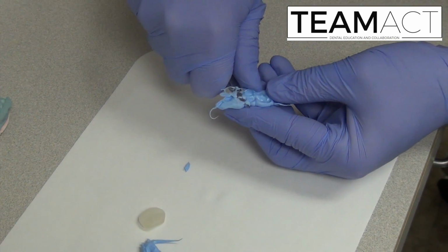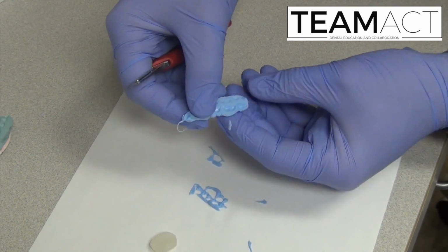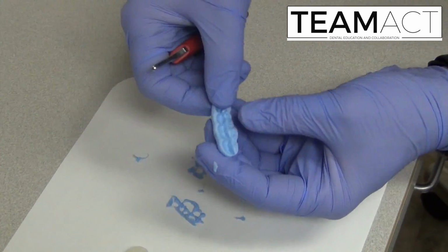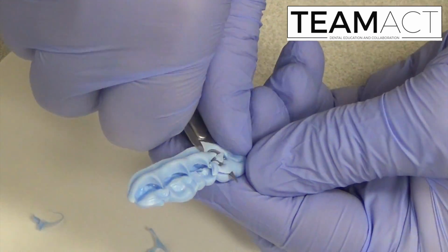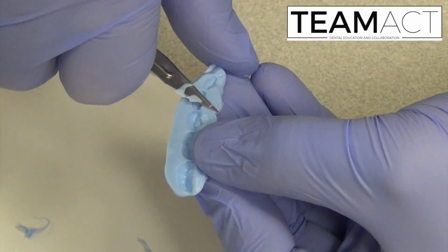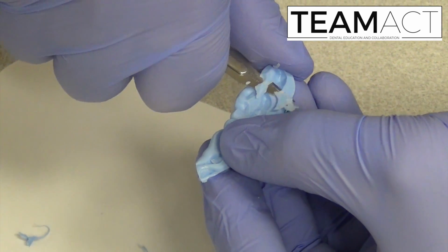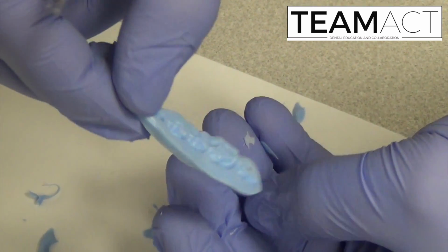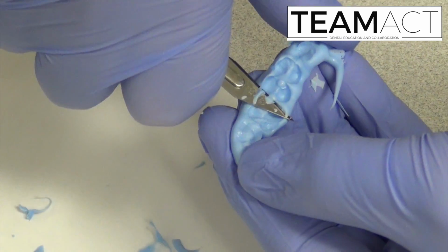To properly trim the CR record, I'm using a 25 blade scalpel. This video is not running real time. It has been sped up to help demonstrate the process, so please be careful as you trim any record as to not cut yourself. As you can see, I'm removing the central anatomy of each tooth as well as any interproximal anatomy, leaving just the residual cusp tips.